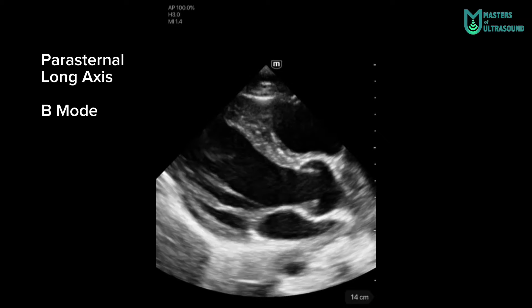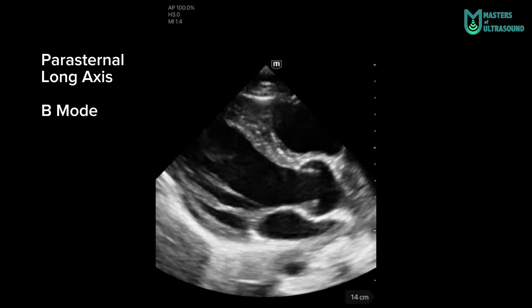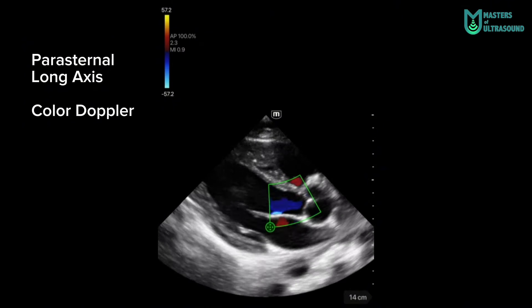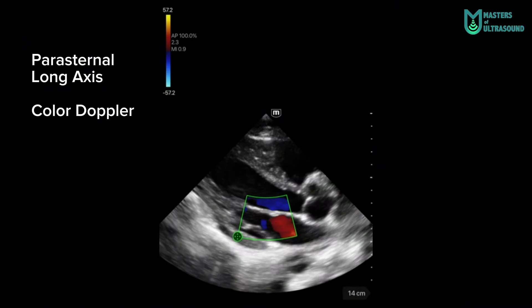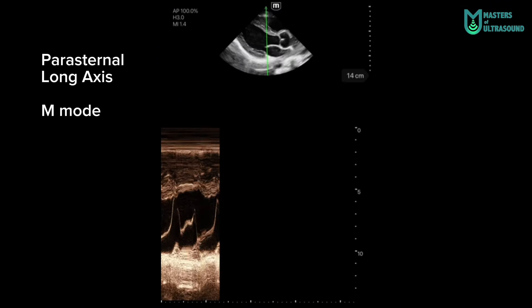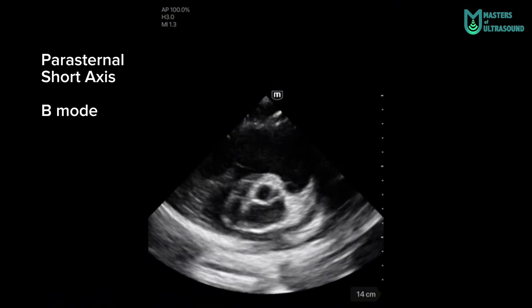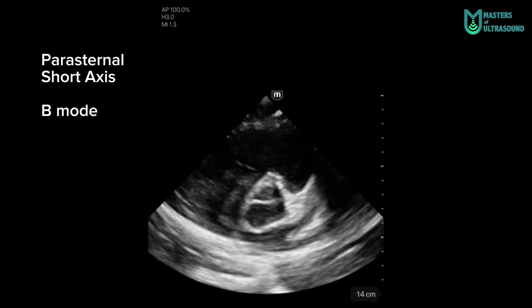Here you can see the clips. Parasternal long axis B-mode of the heart — very good image quality. One of the best color dopplers I have seen in portable handheld devices. Here is an M-mode of the mitral valve, and here is a parasternal short axis at the aortic valve level.